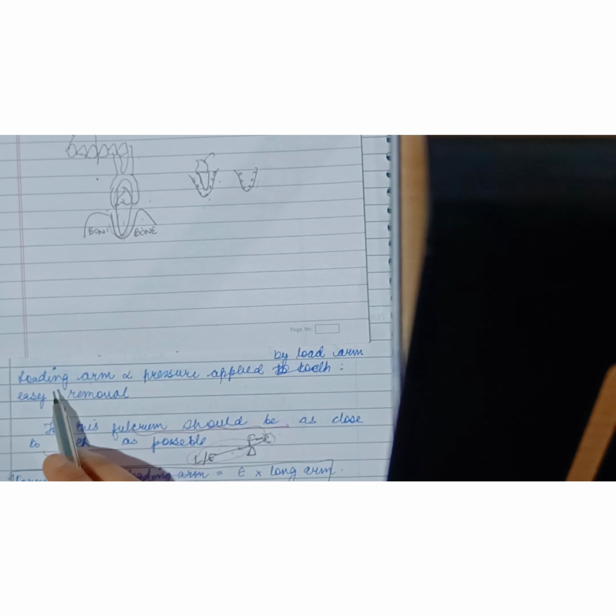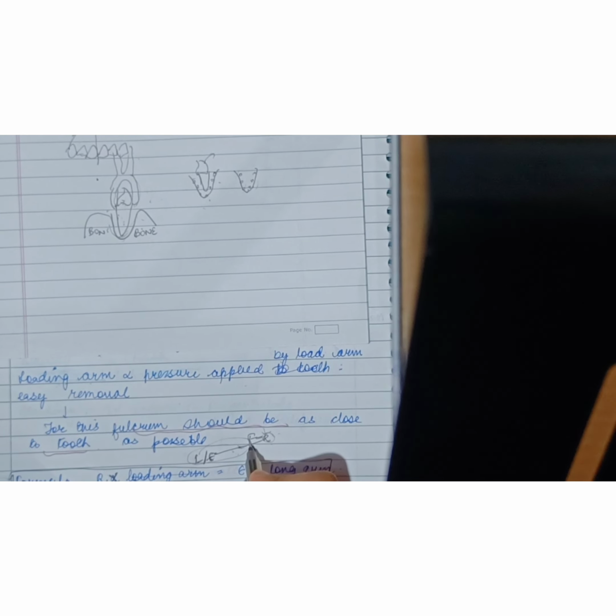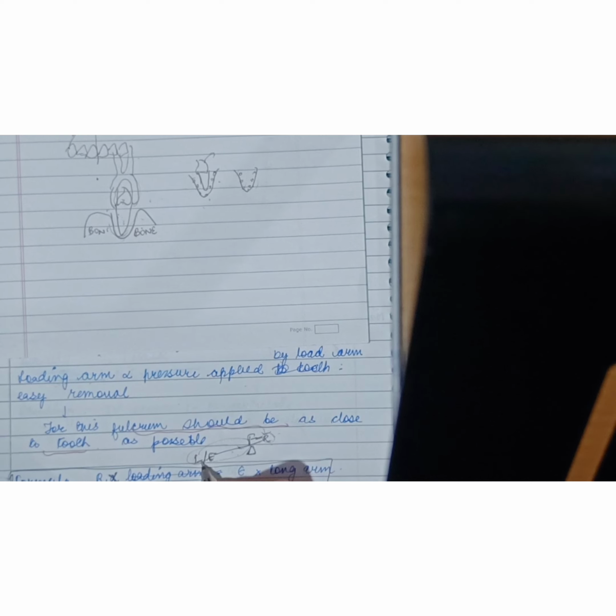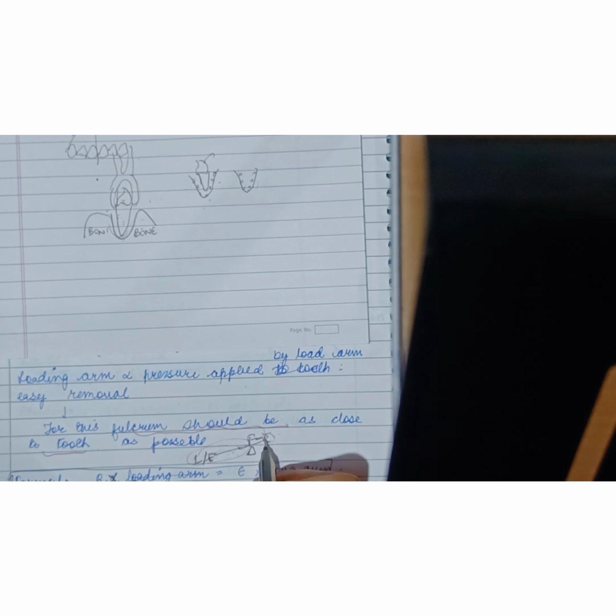Now you have to remember that the greater the length of the loading arm, the more pressure will be applied by the load arm. That is, if this is the effort or load, this is the fulcrum and this is the resistance. So the distance between load, effort and the fulcrum is the length of this loading arm. The greater this length, the greater will be the force, the pressure applied by this arm on the tooth.